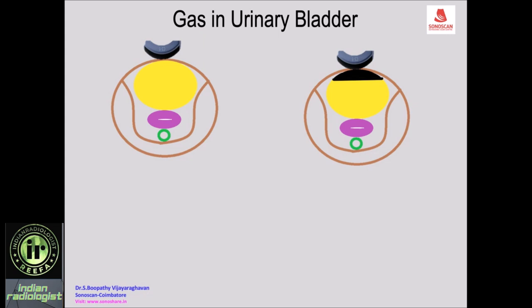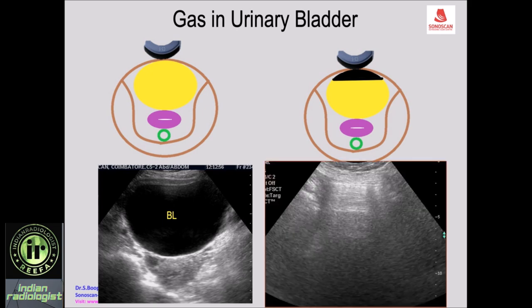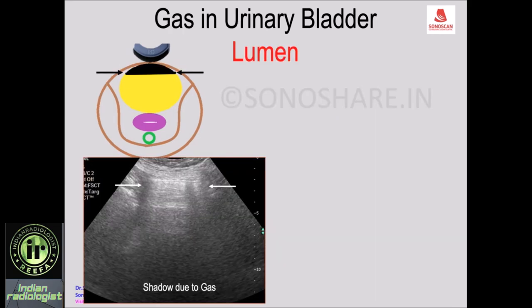So how to differentiate? When there is a normal urine-filled urinary bladder, you see the bladder filled with fluid and you are able to see the uterus and right ovary in a female patient because the fluid allows ultrasound to travel. But when there is gas in the urinary bladder and the patient is supine, the gas is in the anterior part — the non-dependent part — producing an echogenic line with a dirty shadow.